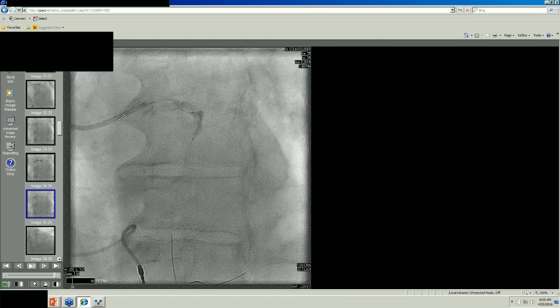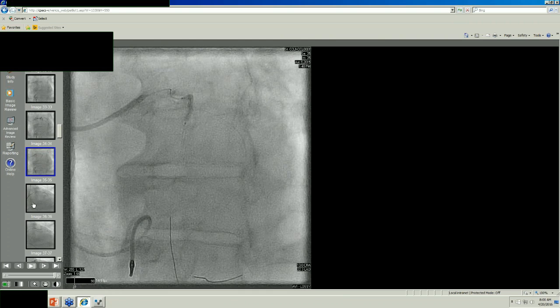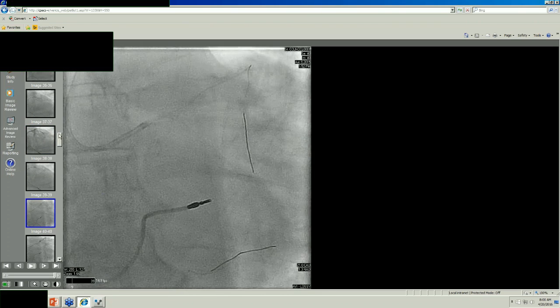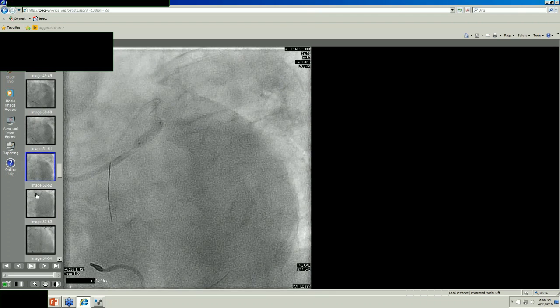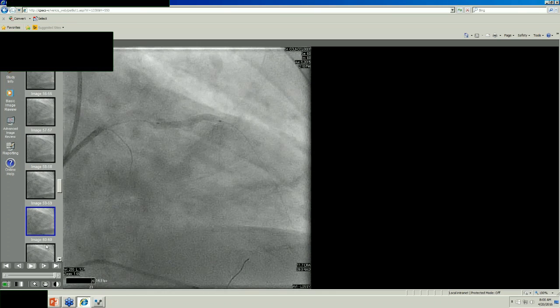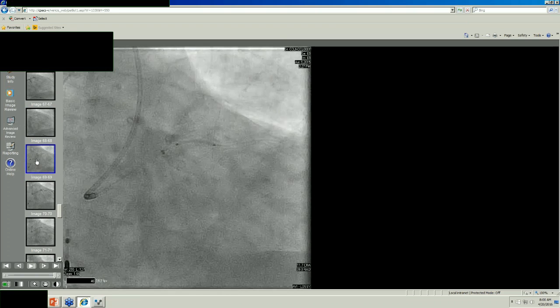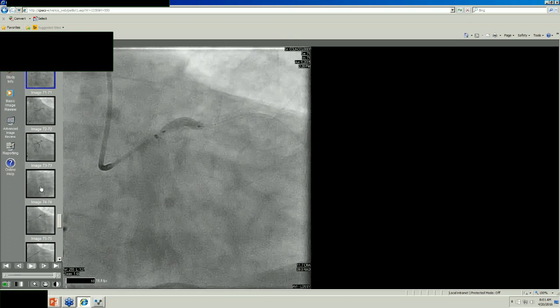There's this. We got a stent being deployed in the LAD that's extending into the main left, and then another stent proximally in circumflex, sort of kissing stents. And so that's what's happening here. Looks like a long procedure, lots of balloons. Distal main artery is being ballooned, but really not being stented. The stent actually goes into from the LAD, looks like it goes into the distal main. Looks like the main was angioplastied.